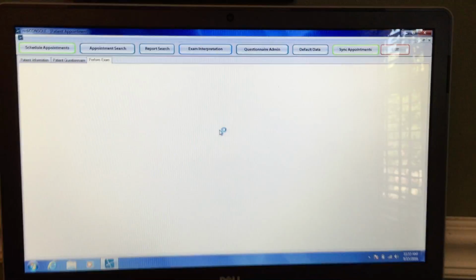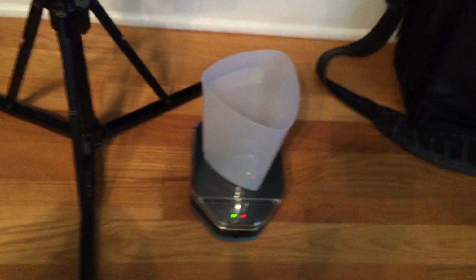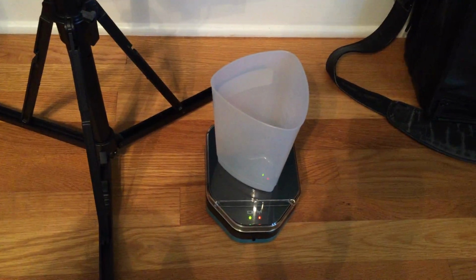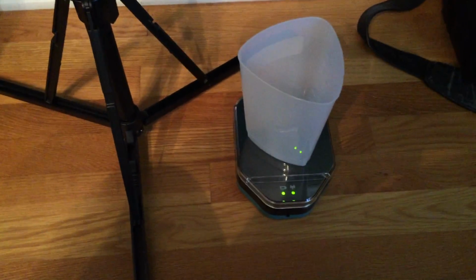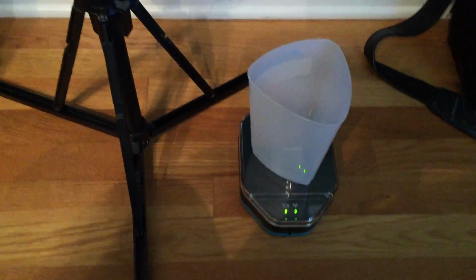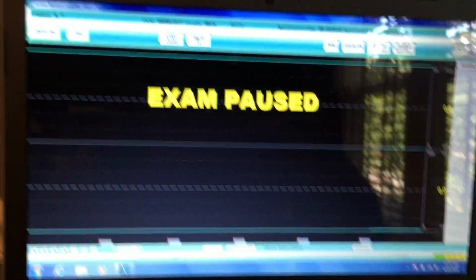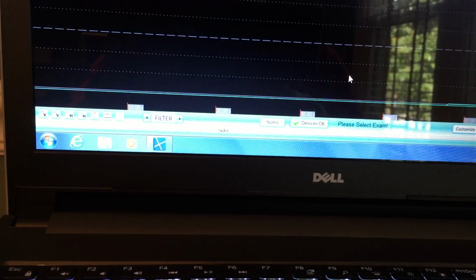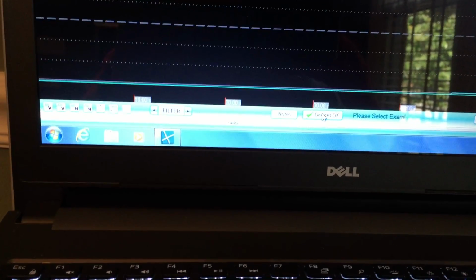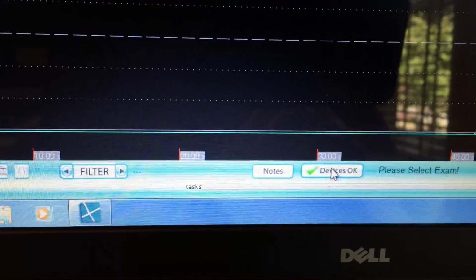As I hit Start Test, the system will automatically start to connect to the Uroflow down the bottom here for our standalone Uroflow to begin with. And if we look up here at the screen itself, it's already connected, and if there's a question whether anything is connected or not, I can come down here to the devices part, and we can see that it says devices are okay.